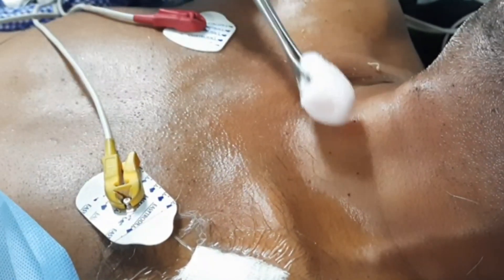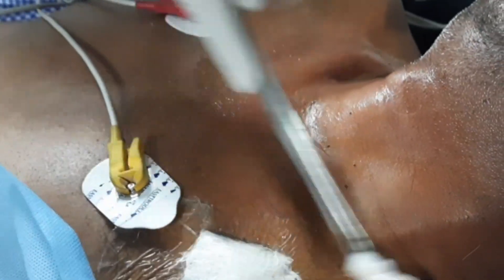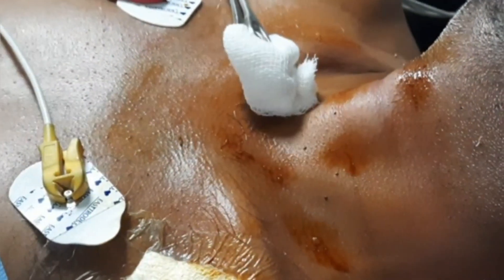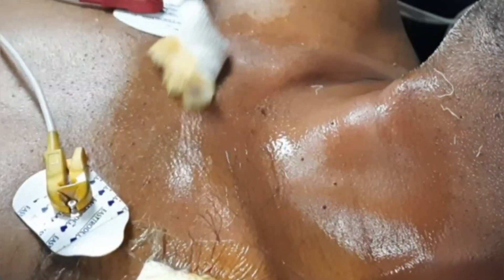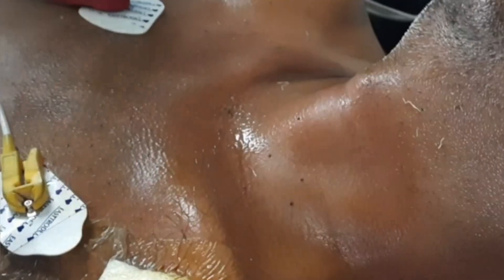Before starting the procedure, we have to sterilize the tracheostomy area with 90% alcohol (spirit), then betadine, then spirit again. We are cleaning with spirit now, and now we are cleaning with 10% povidone iodine. We have to clean up to the shoulders and above the chin. We have to take care of sterility because it helps prevent ventilator-associated pneumonia. This is our final cleaning with 95% alcohol, and we will wait till it gets dry.